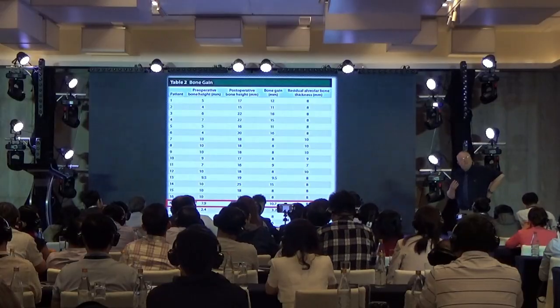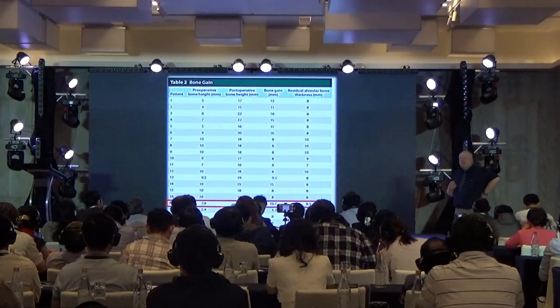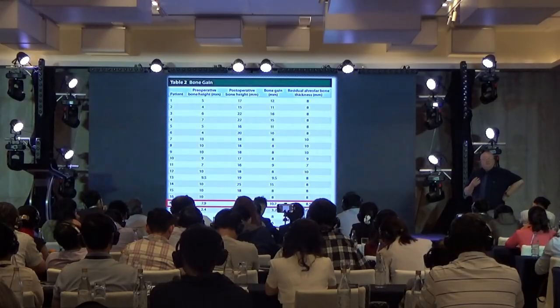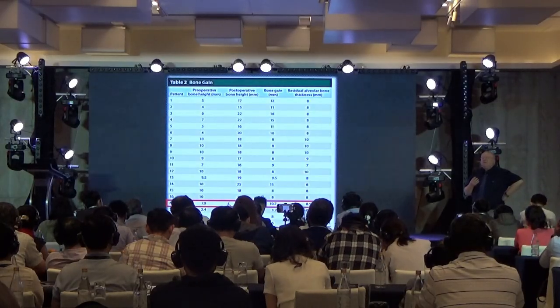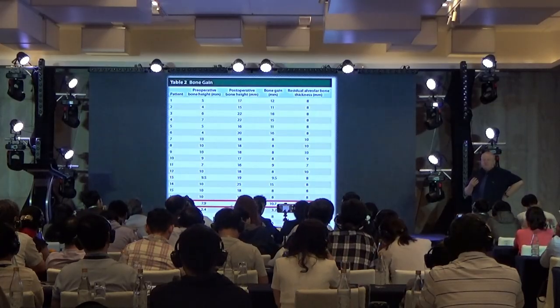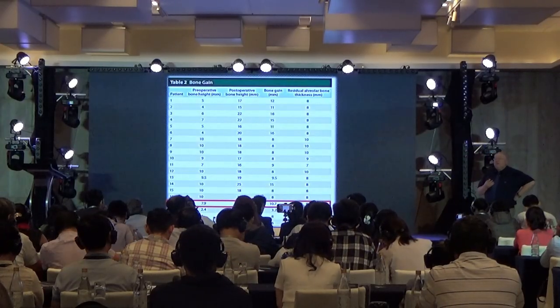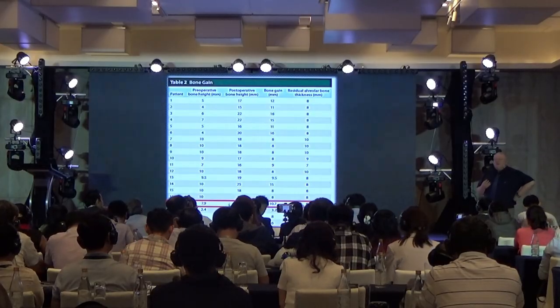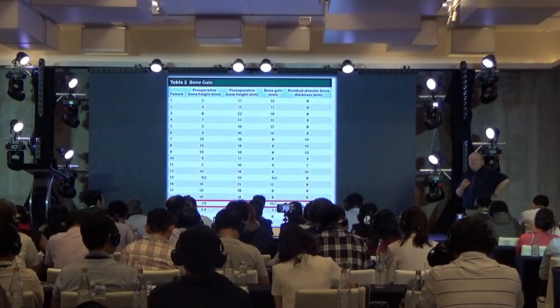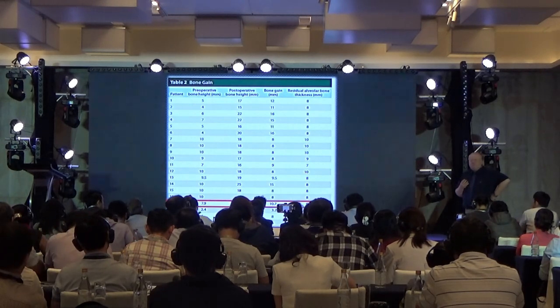And it demonstrates to you that when you ask what is the limit of vertical augmentation, there's actually no limit for vertical augmentation. The limit for vertical augmentation is how much soft tissue release you can achieve. If you achieve enough soft tissue release, you will gain vertical augmentation. The secret of vertical augmentation is soft tissue release. If you do enough, you get bone. If you don't do enough, you will not get bone.